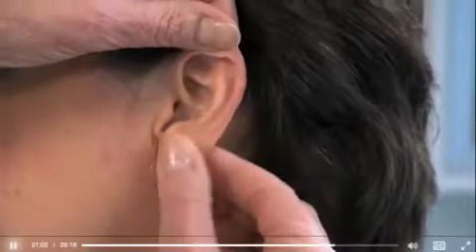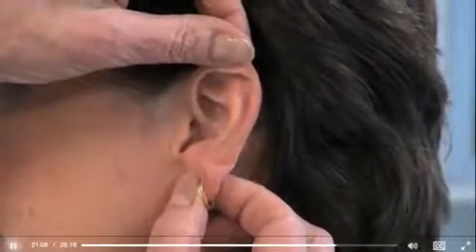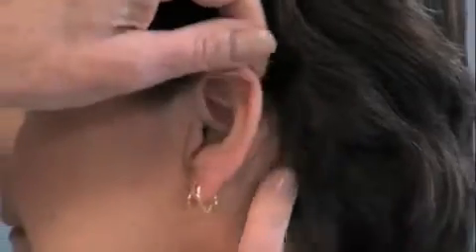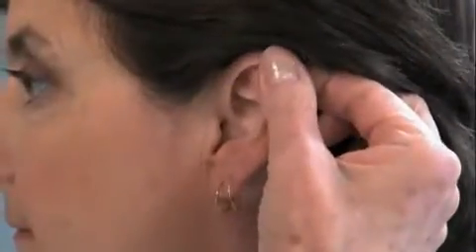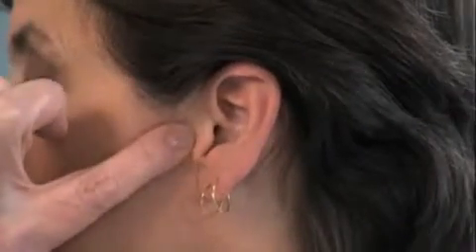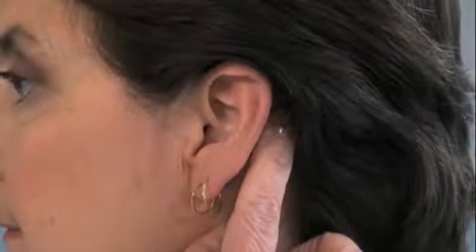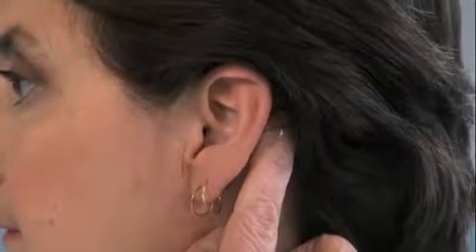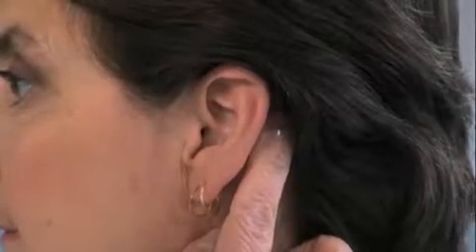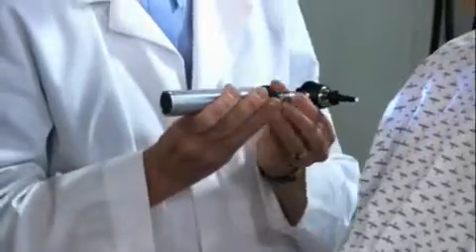Begin the examination of the ear by inspecting the auricle and surrounding tissues for deformities, lumps, or skin lesions. If ear pain, discharge, or inflammation is present, do the tug test to test for otitis externa or external otitis. Move the auricle up and down, press the tragus, and press firmly on the mastoid bone behind the ear. Tenderness here suggests mastoiditis. Next, examine the ear canal and eardrum using an otoscope.